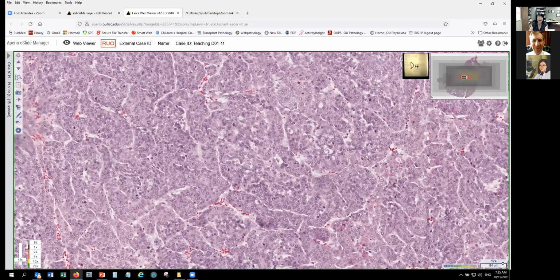Macrotrabecular pattern is defined as trabeculae with each trabecula more than 5 cells thick. Initially it was defined as 20 cells, which is very difficult to reach, but now the definition of more than 5 is called the macrotrabecular pattern.